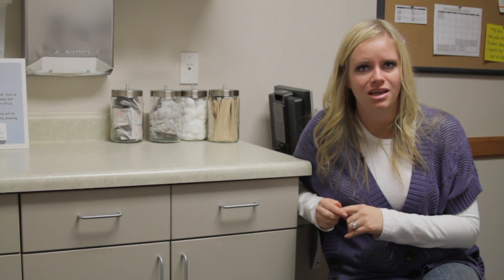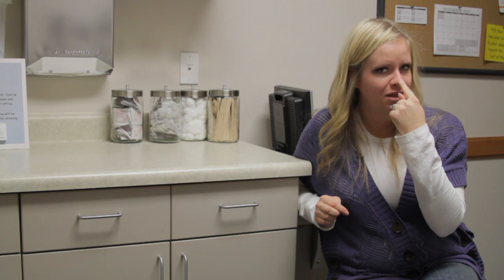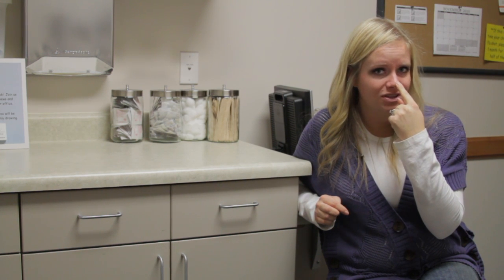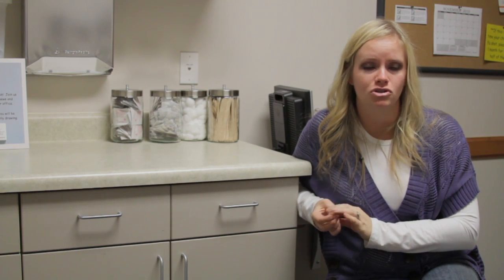So when you're checking for your strings, what I recommend is you reach all the way up into the vaginal area, reach up till you feel something that feels like your nose. The cervix kind of feels like the tip of your nose, and you want to do just a sweep around there and see if you can feel the strings that are there.